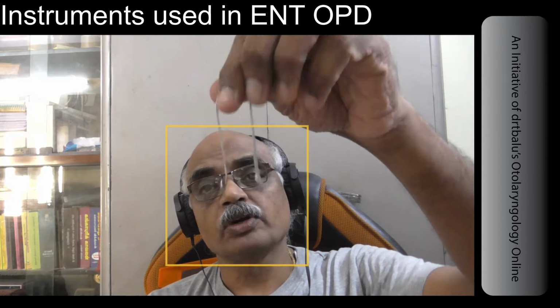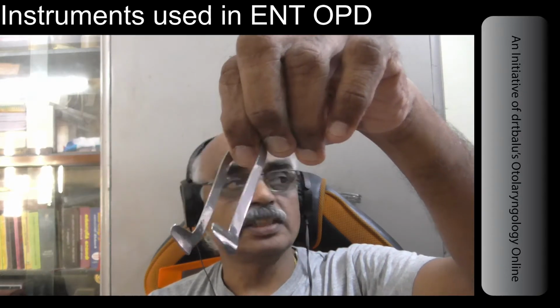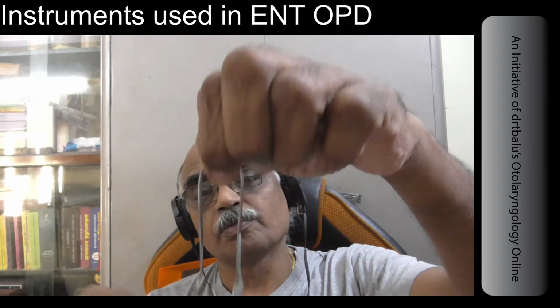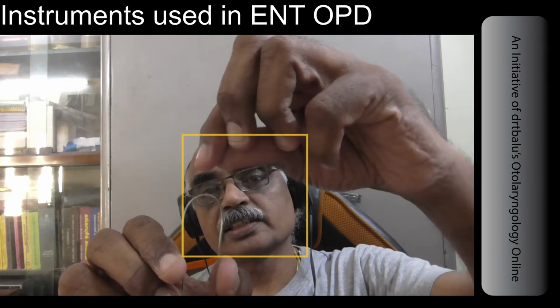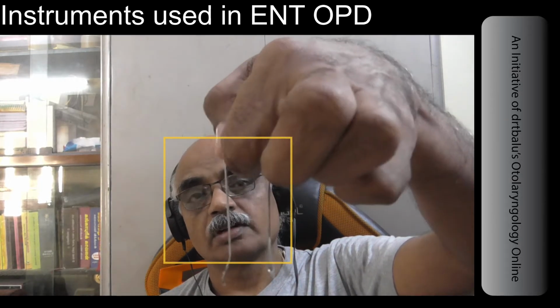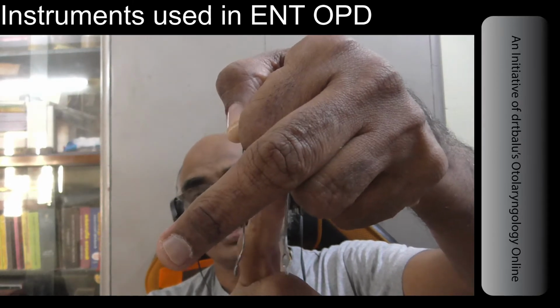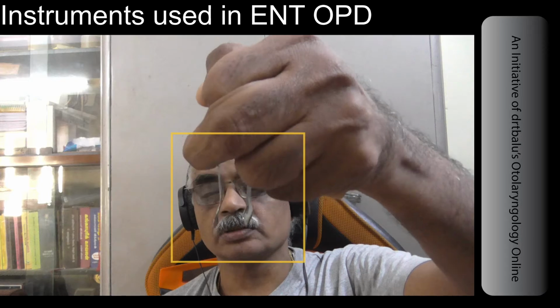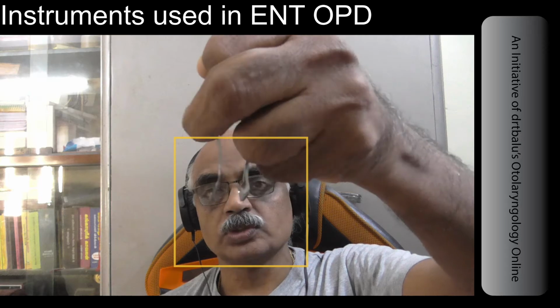The next instrument I am going to show you is Thudicum's nasal speculum. The design of this speculum is 150 years old, so it has undergone very little modification. It has two limbs, one vertical and one horizontal, and a shoulder holding the limbs together. You hook the Thudicum speculum by the index finger, stabilize the left limb with your ring finger, and then use your middle finger to compress it. Use it to visualize the nasal cavity proper. So this is how you use the nasal speculum.